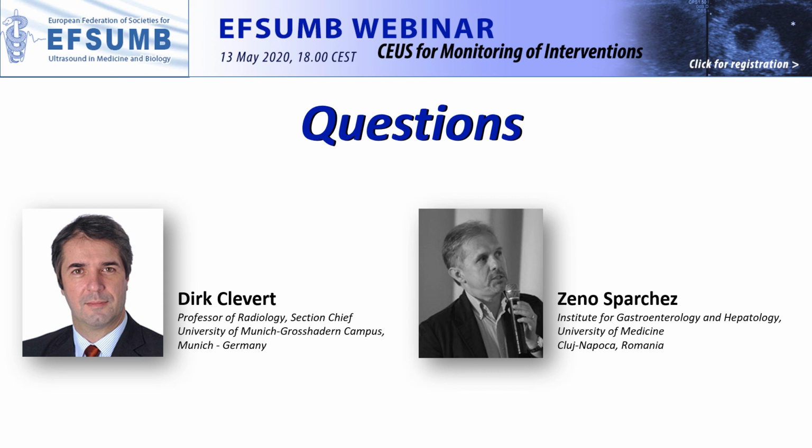So usually we have the information from CT or MRI. We know from that examination where that lesion is located, and we focus with contrast on that part. If it's a metastasis, it's not a problem because we have enough time to detect it in the parenchymal phase. If it's an HCC without washout, then it's more difficult because we don't have enough time to see all that region. And if you are not successful after the first attempt, we can re-inject another dose of Sonoview in order to detect that lesion. Or in cases where we cannot do this, we also use fusion to see better where the lesion is located. But usually with contrast, we are able to detect almost all lesions in the liver.